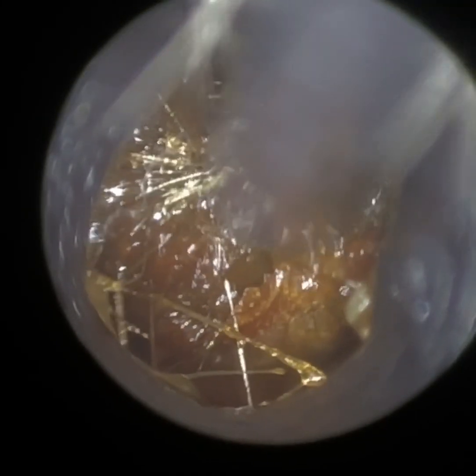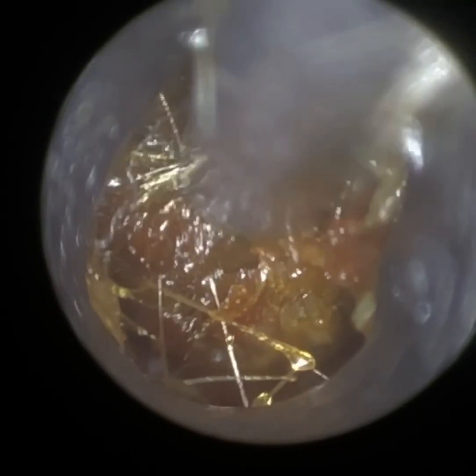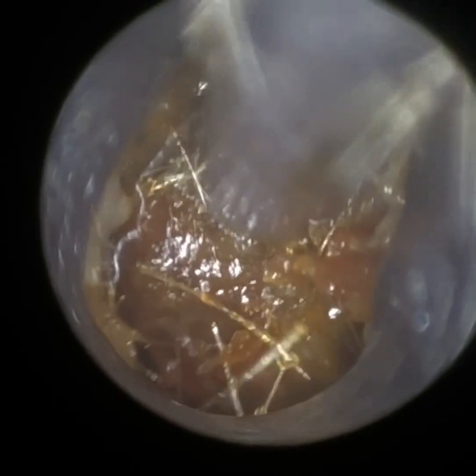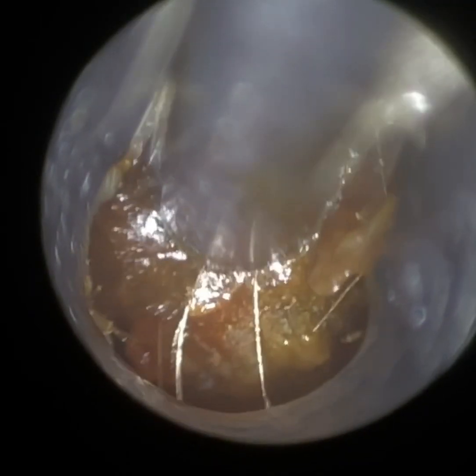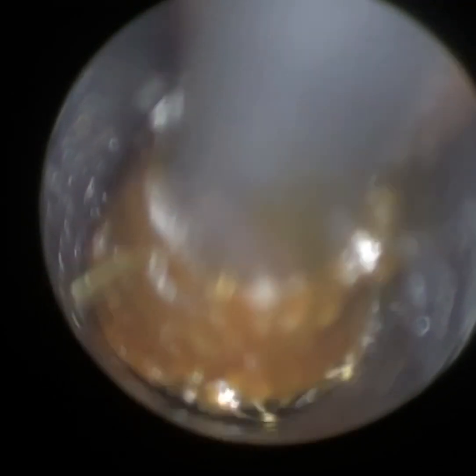No doubt these sleep plugs have been further compressing this wax. It's really compressed, quite wet and sticky and stodgy. There's a few hairs there as well, it's slightly matted. I'm just trying to tease this out but it is really compressed right up against the eardrum. Once I remove all the occluding wax, there is some residual staining on the drum which we just left — I wasn't too concerned by that. The symptoms had been alleviated.